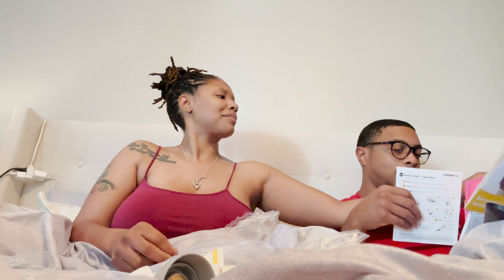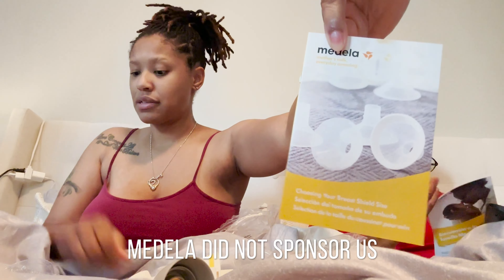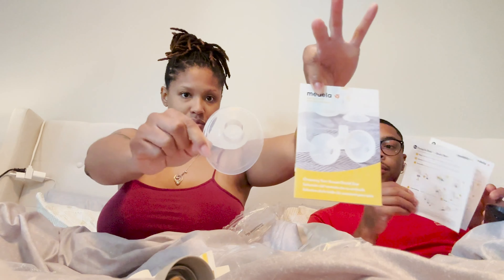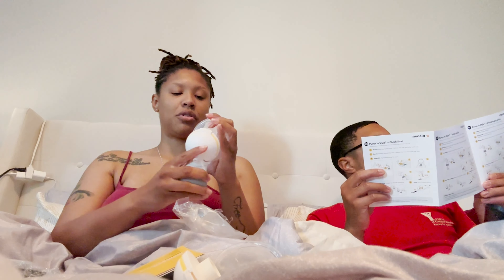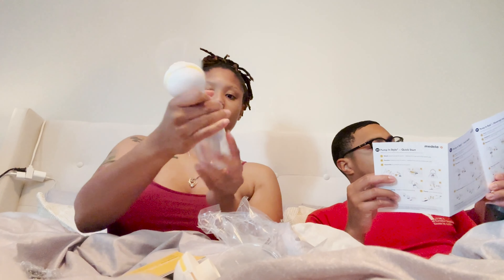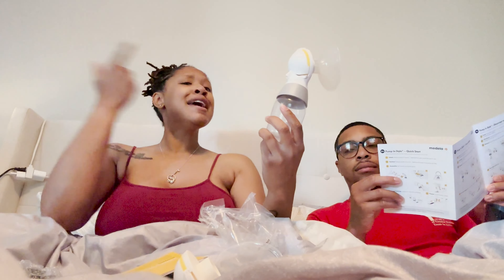Give me this — this talks about choosing your breast shield size. So this is the breast shield and I'm pretty sure this goes on like that, yeah like that, and then it connects to this. Oh we're getting somewhere! I already know how to do it, I don't need you anymore. And then you twist the bottom on like this — who needs the instructions?